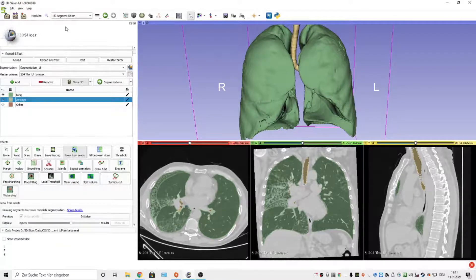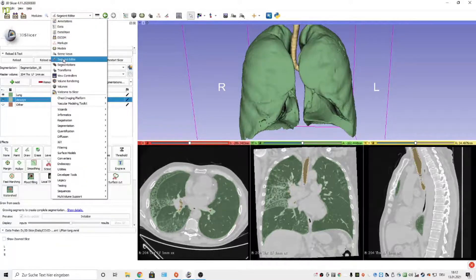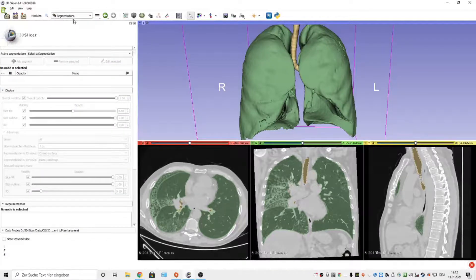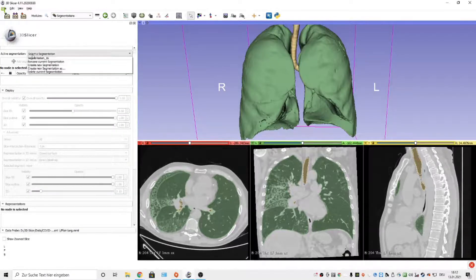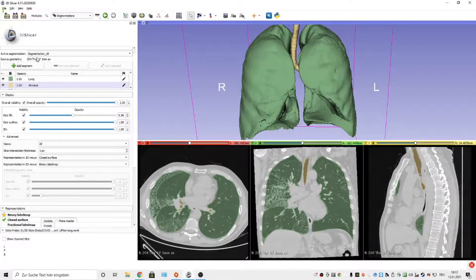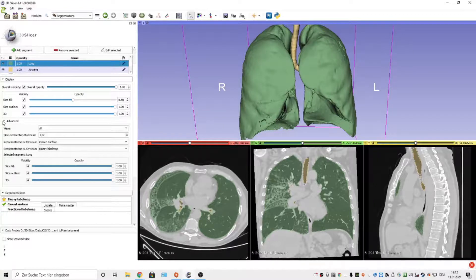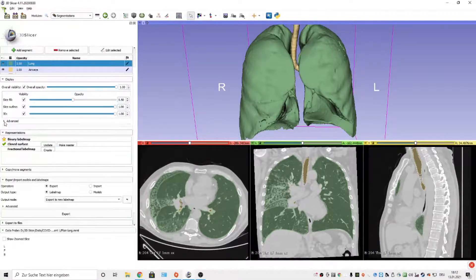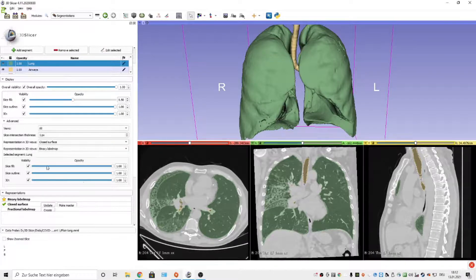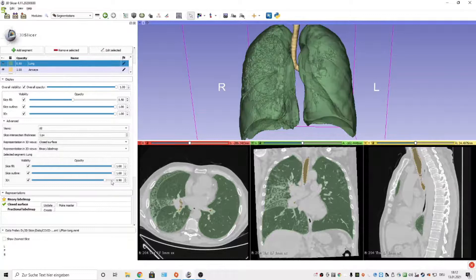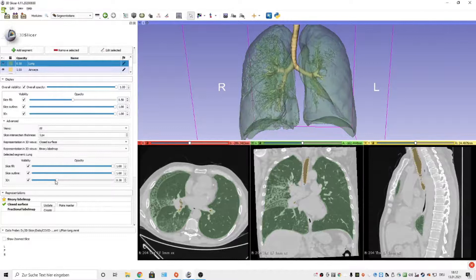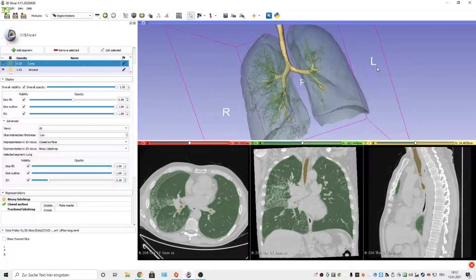And for you to be able to see the airways, I will show you how to do that. You go to Segmentations, select the newly created segmentation, select Lung, and then there's a tab called Advanced. You go to the 3D slider and move that back, and now the airways shine through.